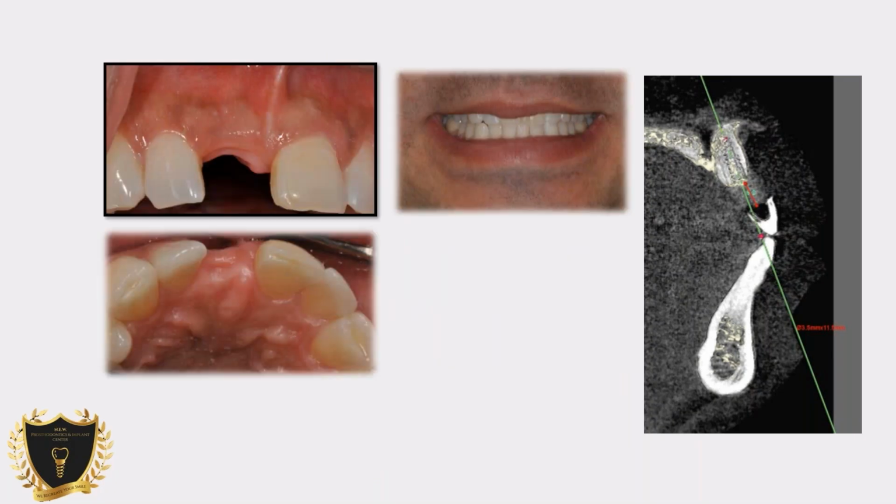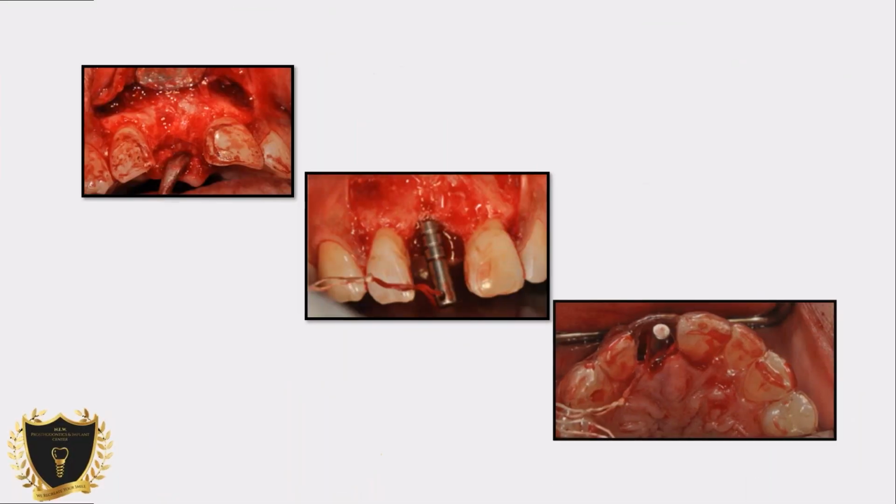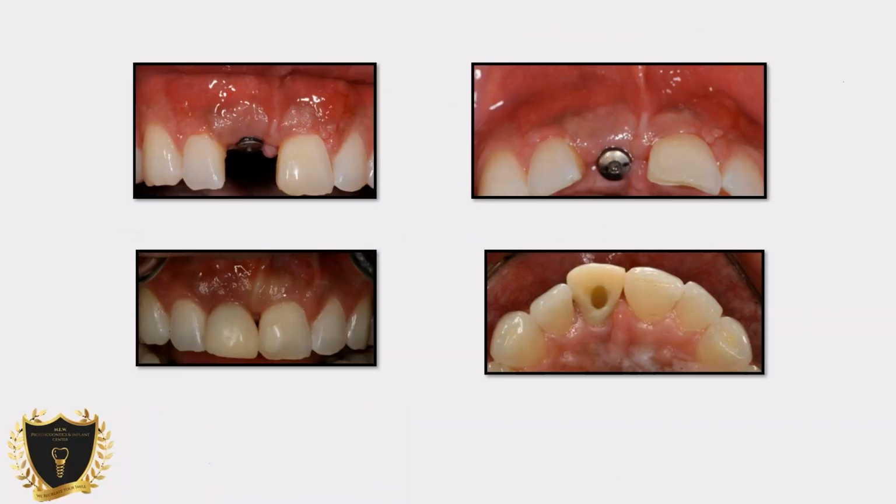So, a patient in the anterior zone. My wife is a periodontist, so she referred to her. She planned it and placed an implant at number 8 site. You can see some deficiency over there. It needed implant placement and some grafting, which was achieved at the time of surgery. That was the plan. Placed the biologics, closed everything. Decided not to load because of obvious reasons. Let it heal. This is a provisional for that restoration. You can see the access hole coming from the lingual.